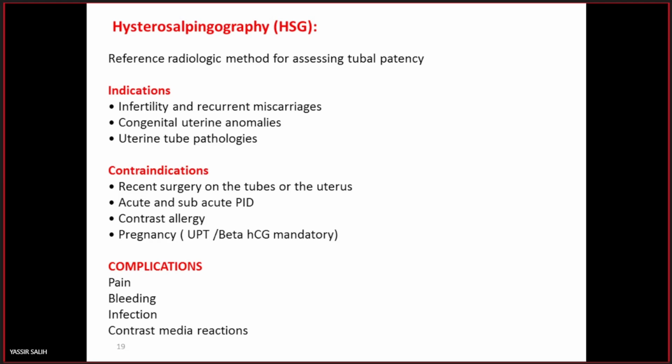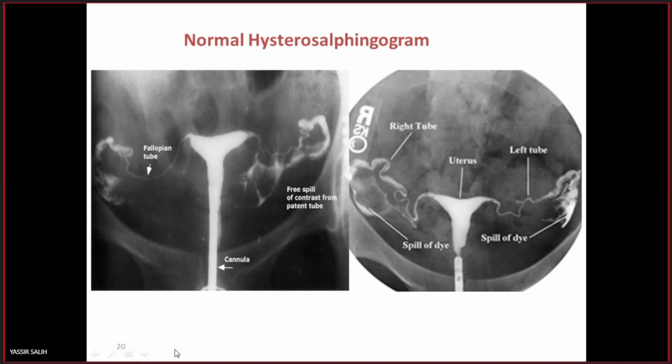لذلك احنا زي ما قلنا لكم بنبدا دائما نعمل within the first 10 days، يعني بسموها safe days دي. Complications are not common, but the patient may complain of pain, according to يعني ممكن يكون mild pain to severe, but usually there is a mild pain. Bleeding, although it is not common. Infection sometimes can occur, and contrast media reaction.